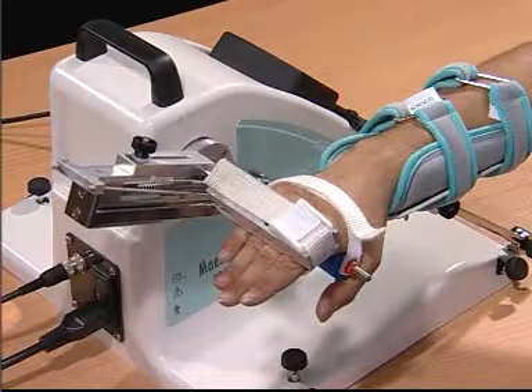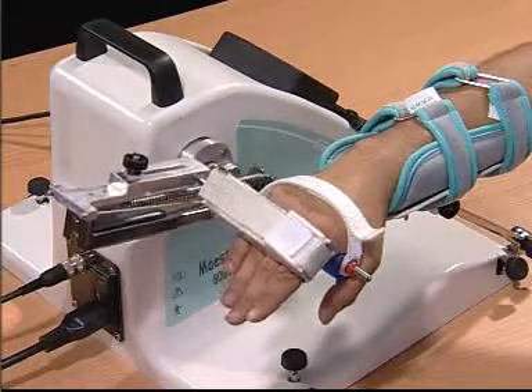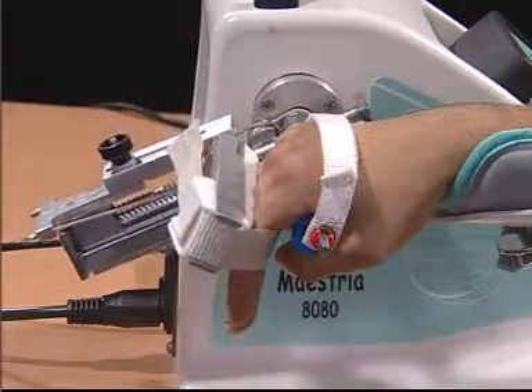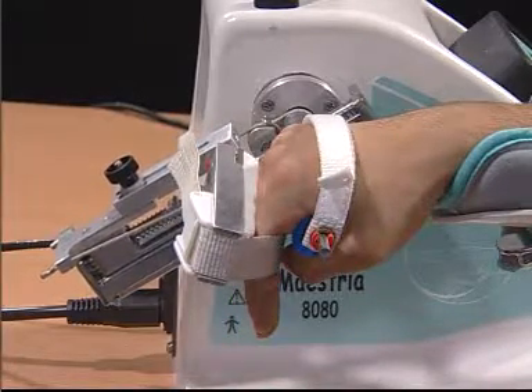We can obtain zero degrees of extension to 90 degrees of flexion. Make sure the alignment is proper, therefore no compression of the joints will take place.